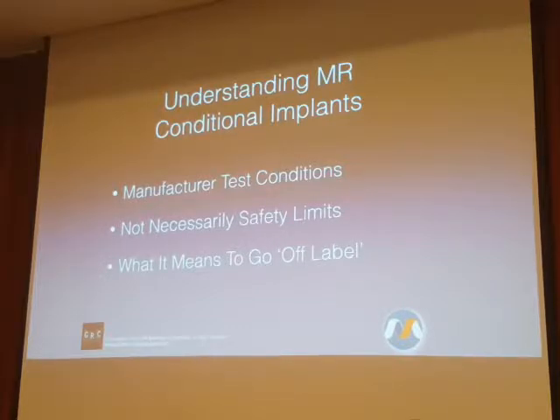Now, there are lots of places in and around magnets, especially 3T systems or even high field opens, where the spatial gradient is higher than 720. And so this manufacturer wanted to update their labeling. So you can do what's called an extrapolation test. Mathematically, if you know that it deflected 3 degrees under a certain set of conditions, you can do the math and you can figure out how much it would need to be exposed to make it go up to 45, the magic tipping point, right?